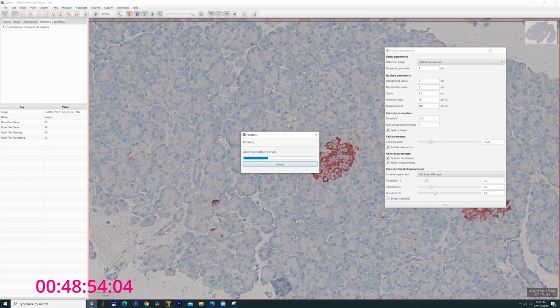which was, like I said before, me going through this, exporting this file into Photoshop, where I'm doing a very similar process of trying to mask a single channel out, sort of the equivalent of pushing the number 2 or number 3 key on this keyboard. And the issues of those artifacts are still there. You still have those brown patches or folds or scratches that are going to show up in the mask, and then trying to set a threshold.